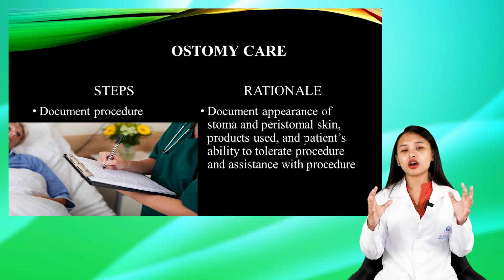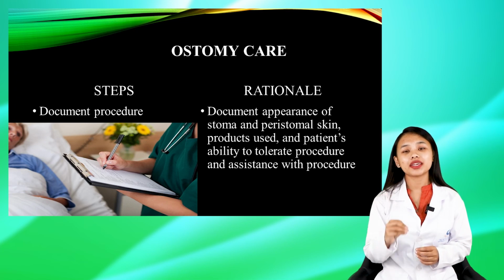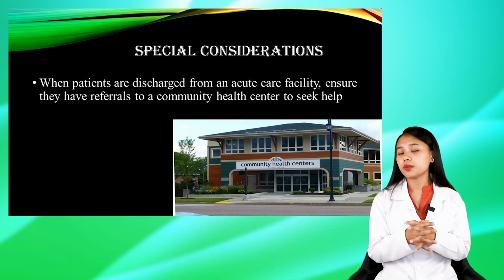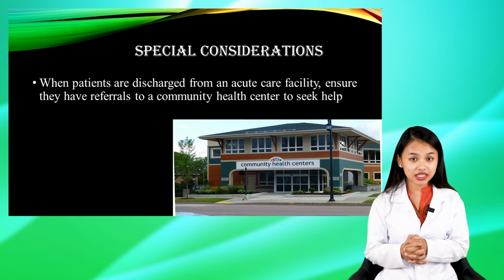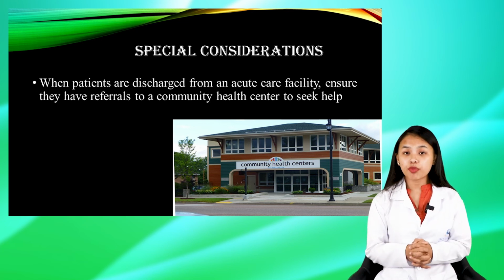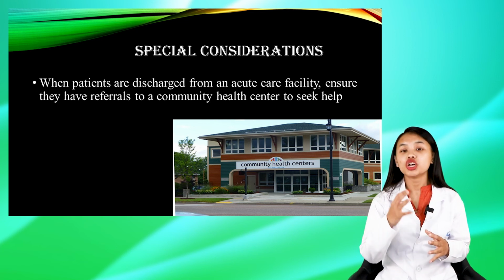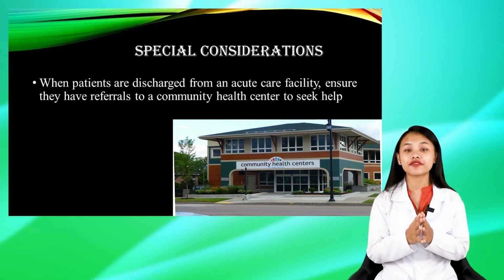So here, these are the various steps that you need to follow when you are providing care to a patient with an ostomy. Here, as a nurse, there are also certain points that you must keep in mind. The first one is when the patients are discharged from an acute care facility, it is your responsibility to ensure that they have referral to a community health center in order to seek help.